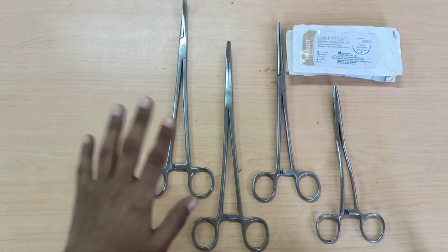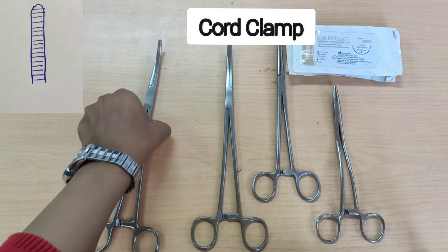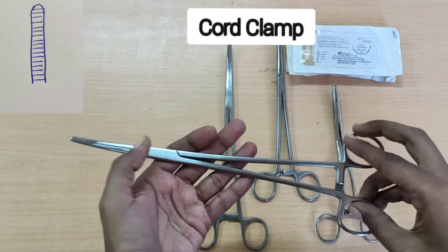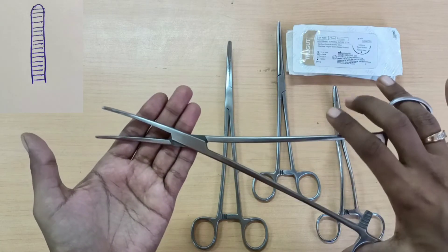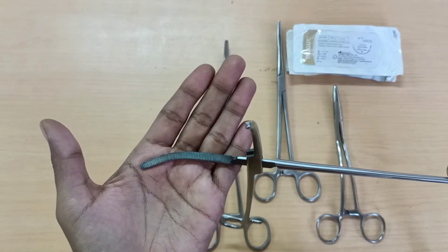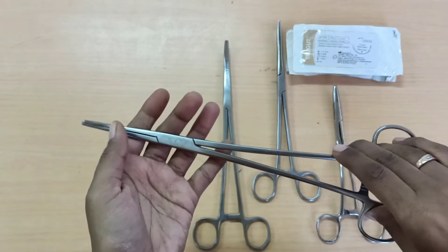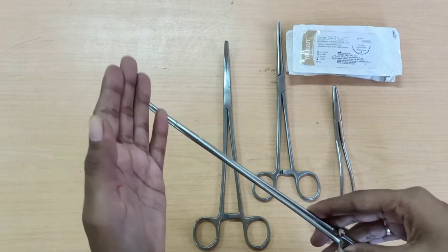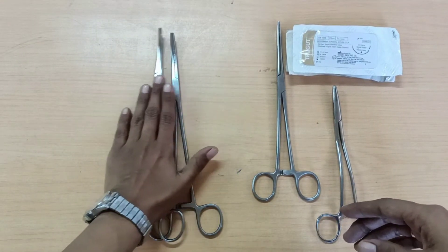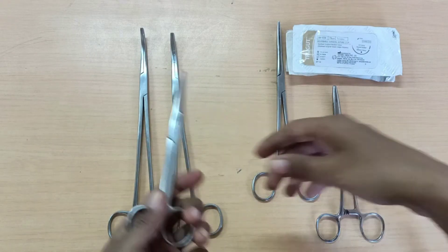The baby is out and is attached to the placenta with the cord. You are now going to require two cord clamps. These are the cord clamps — they have a lock and are just like a big artery forceps with transverse serrations over the working end to have a good grasp on the cord. One clamp is for the maternal side and the other for the baby side, and when you have clamped both sides you cut in between, requiring a pair of scissors for that.